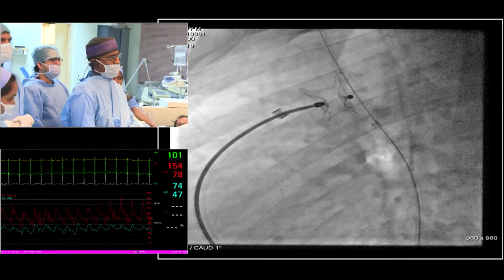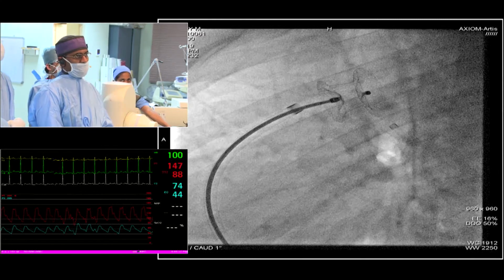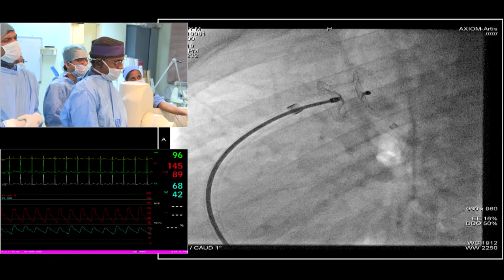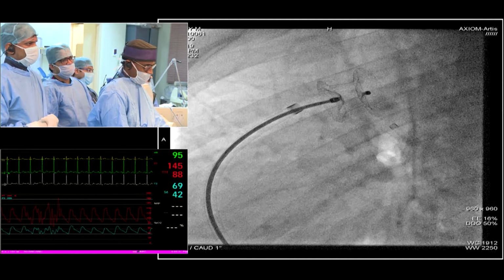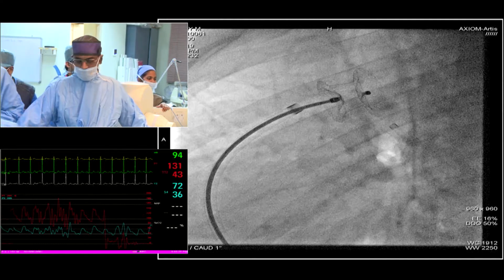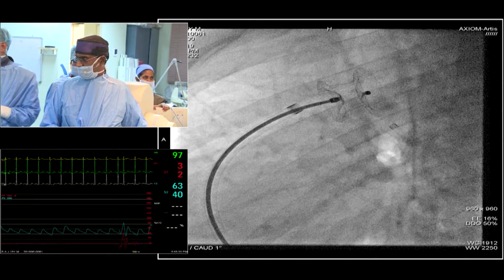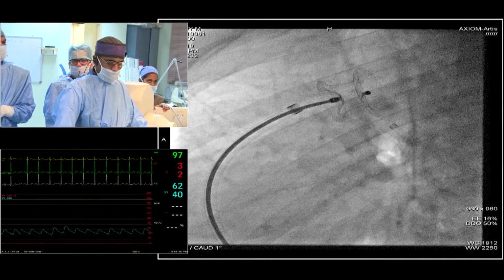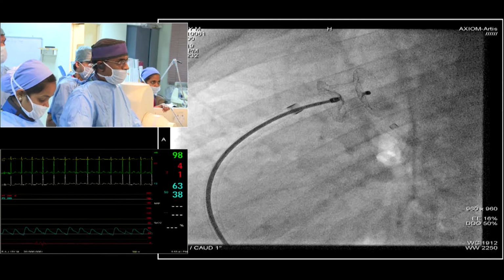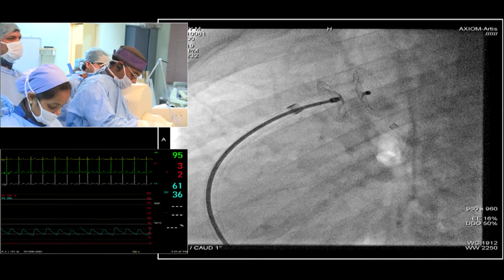Now I have either side of the device, one facing the aortic side and another facing the PA side, and these are the pressure hemodynamics now. Looks super good, but is the device too far in the pulmonary artery, or do we have to be aware? I don't know exactly, it looks that way from here. I will show you an angiography. I want a 20 cc syringe. The PA pressures are coming nicely low. We are going to give an angio.